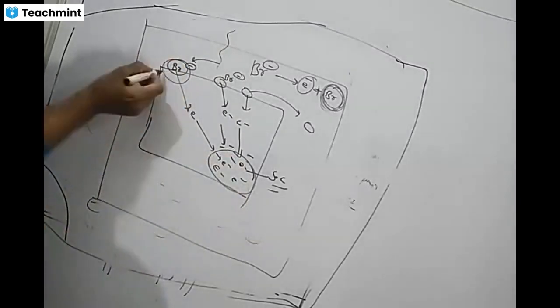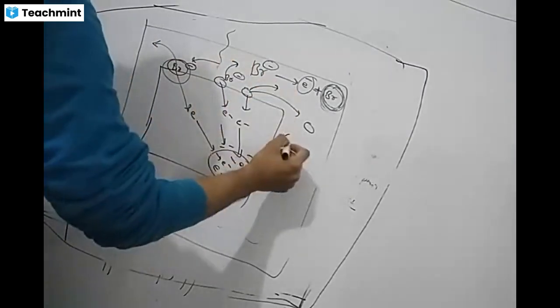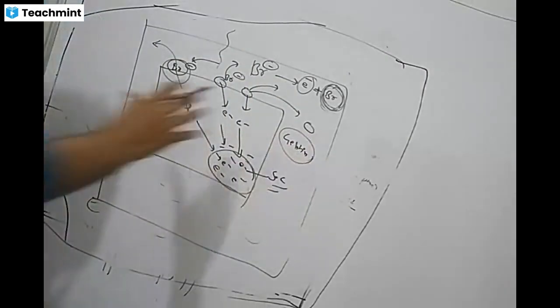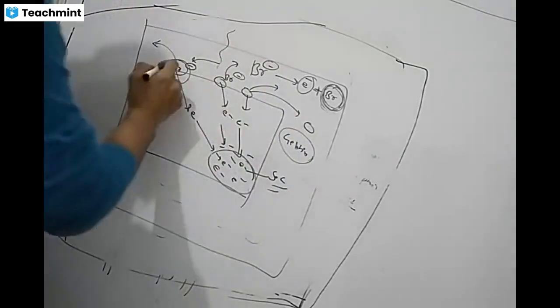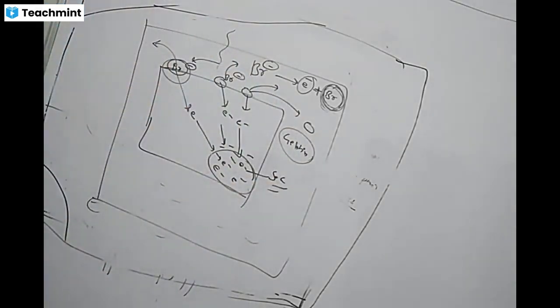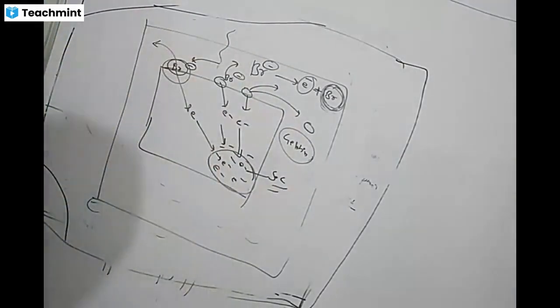And this atom will move into the gelatin, because the emulsion has gelatin and crystals. So from the crystal lattice, it will move out. Slowly, the crystal structure becomes disrupted because these bromines are moving out of the structure.